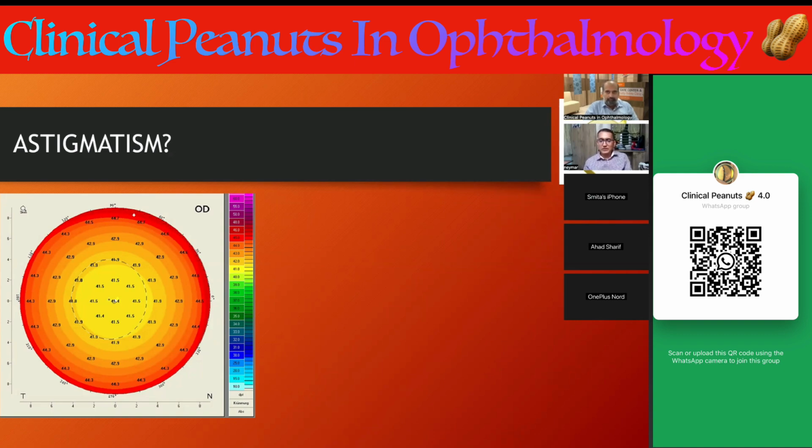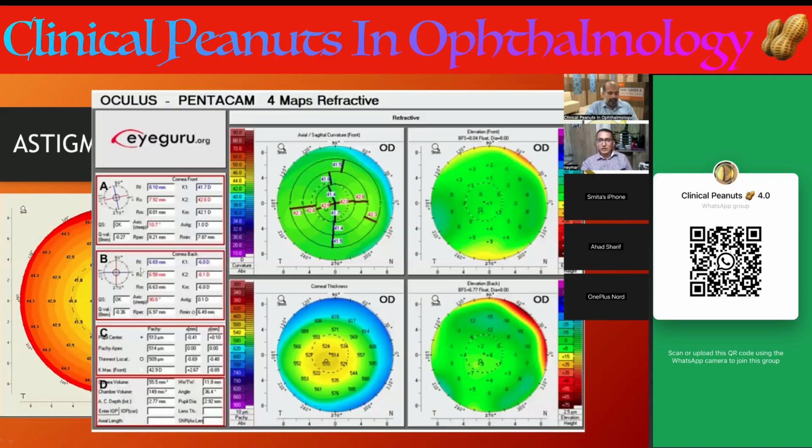But nowadays, since the shift is there in the perception and in the scientific innovation in every branch of ophthalmology, the cataract surgery is nowadays refractive surgery also. So we try to give the patient the spectacle-free visual experience. So astigmatism is the component which is there on the cornea. If you look at the corneal power map, you will find that the distribution of power over the cornea is not uniform. Whenever the power distribution is oriented in one axis and the other axis is steep or flat, which is there at 90 degrees in most of the cases, we call it regular astigmatism.